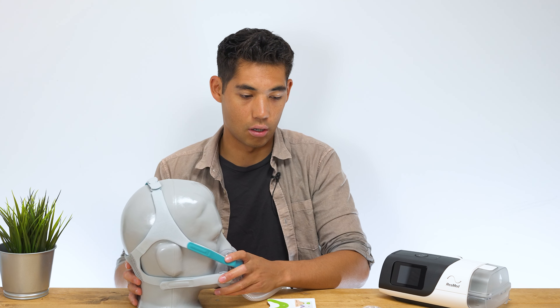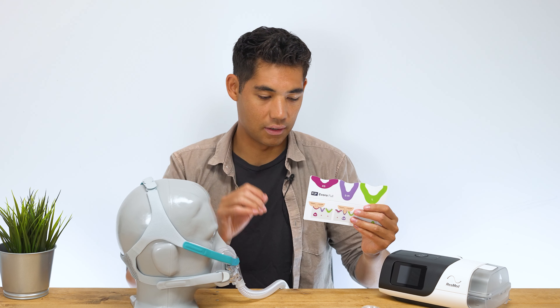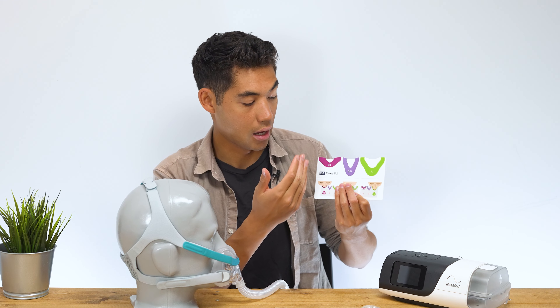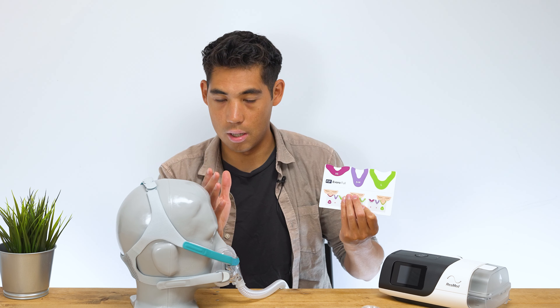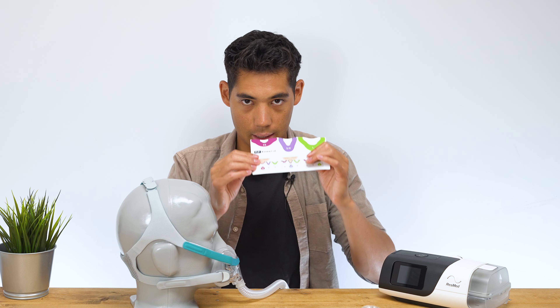Right now mounted on the mask I have the extra small cushion. The fit pack also comes with the medium and the large cushion. A little side note: the small is actually considered an extra small, the small medium is the middle option, and the large is the largest option — not sure why they went that way. I've measured my nose and I'm usually a small, and with this it's no different — I am an extra small.